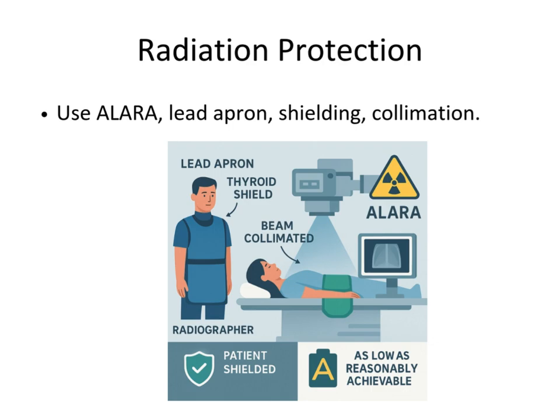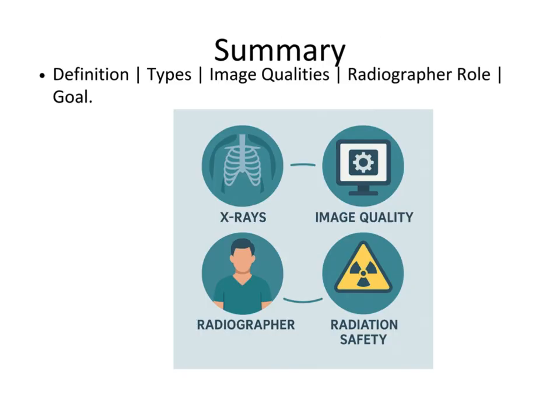Slide 13, Radiation Protection. Safety is always a top priority. Apply the ALARA principle, as low as reasonably achievable. Use lead aprons, thyroid shields, and gonadal protection. Always limit the beam to the area of interest and maintain proper distance and shielding.